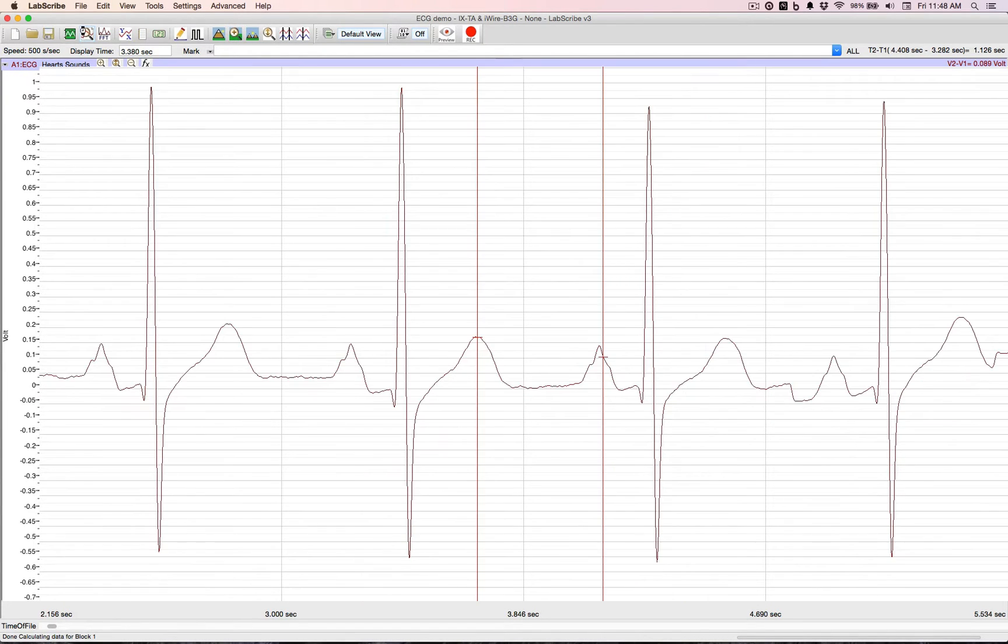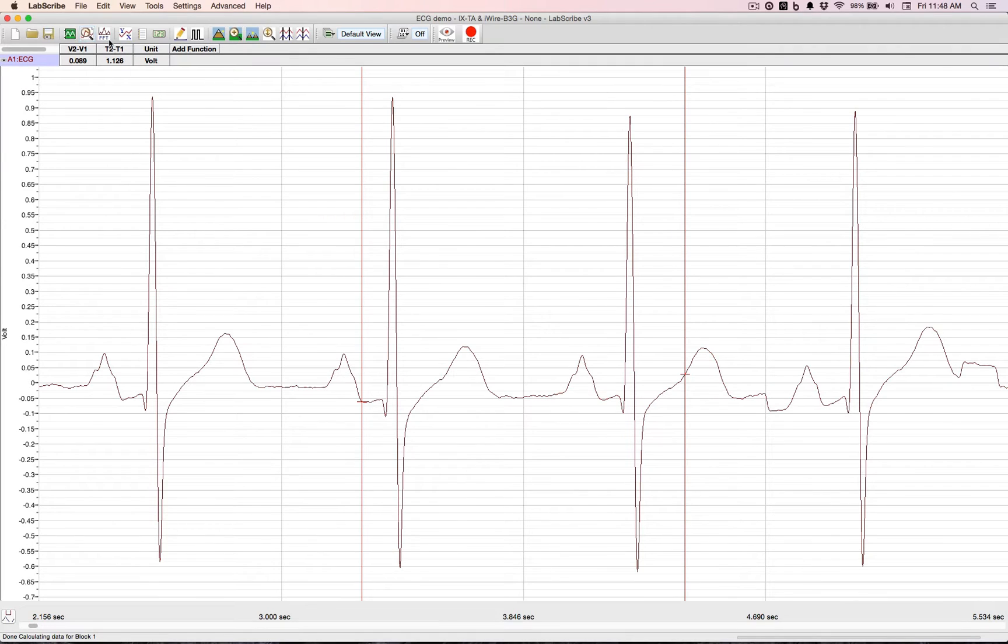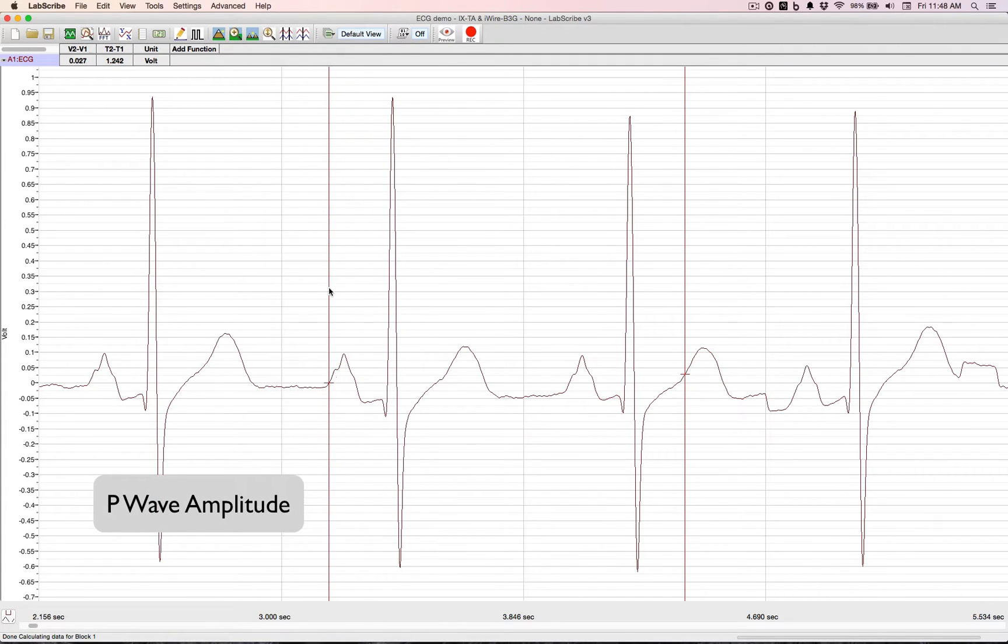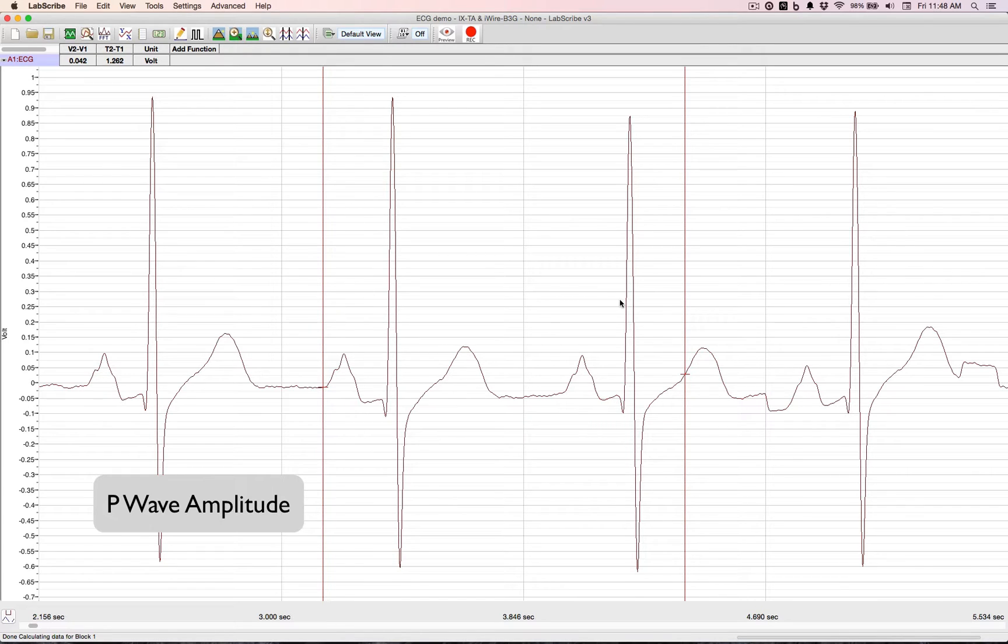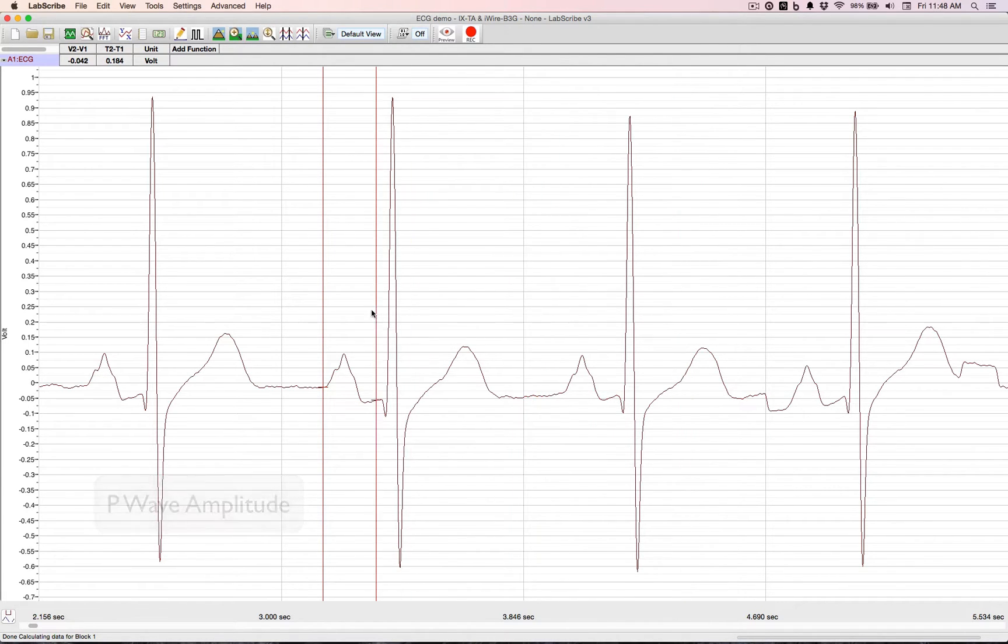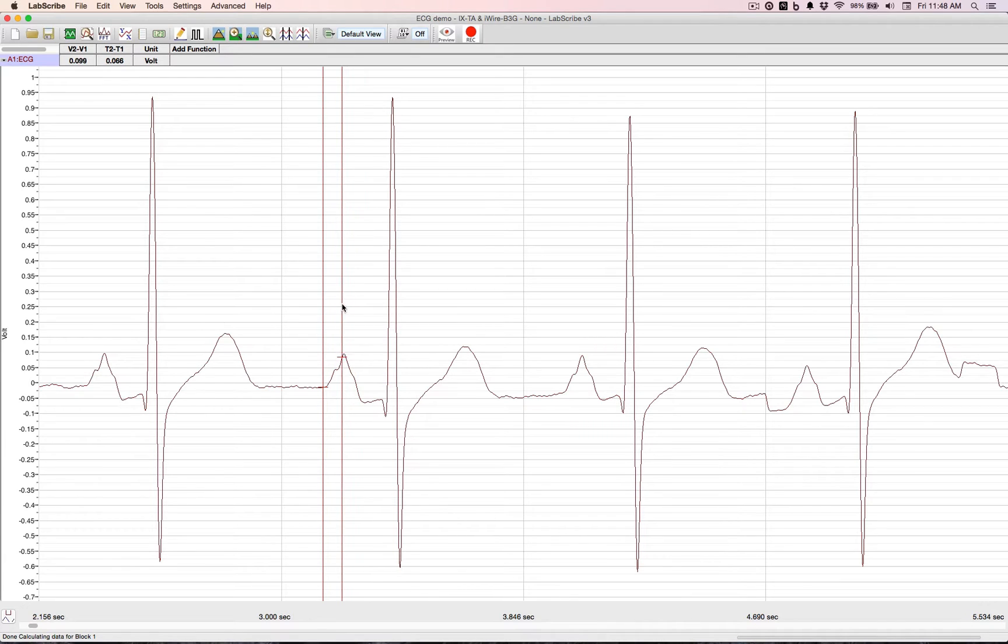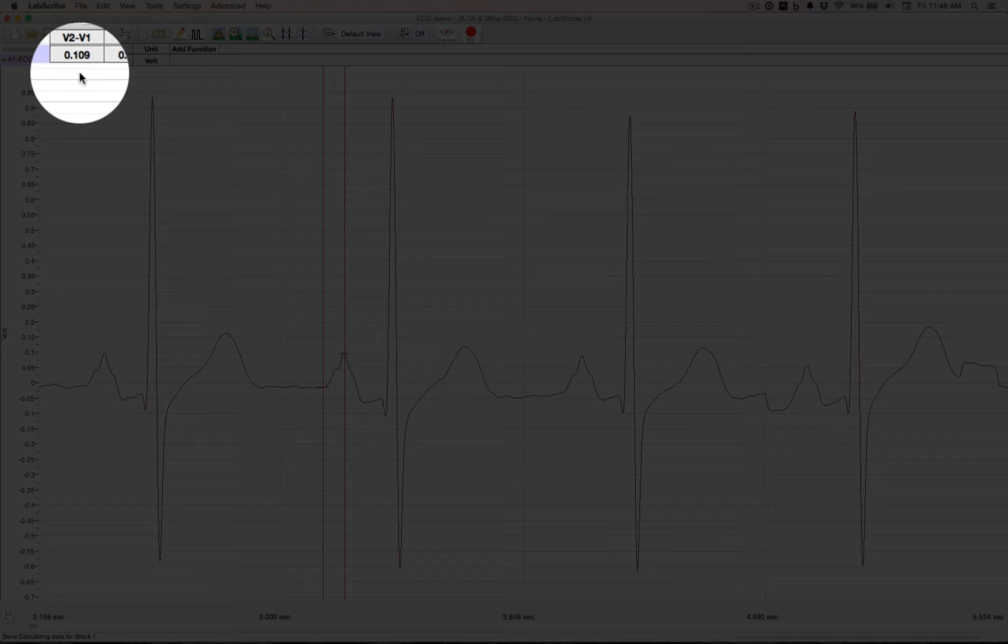The first thing, let's do a P wave amplitude. Take your cursor, put it on the flat portion before the P. The other one at the top of the P wave. That's 109 millivolts.